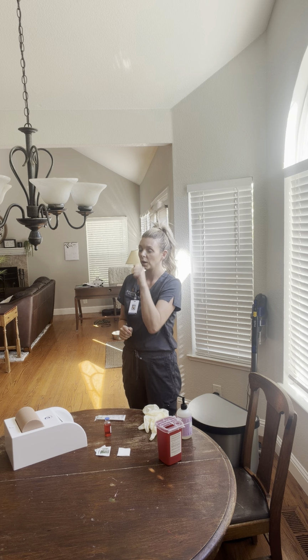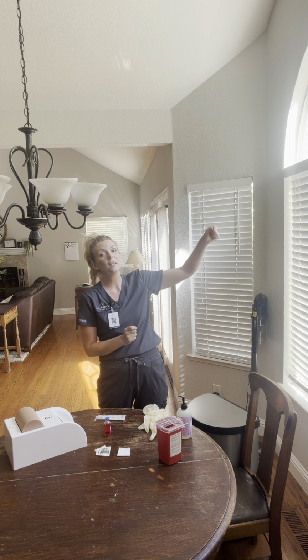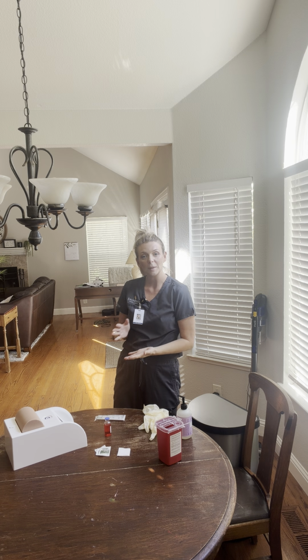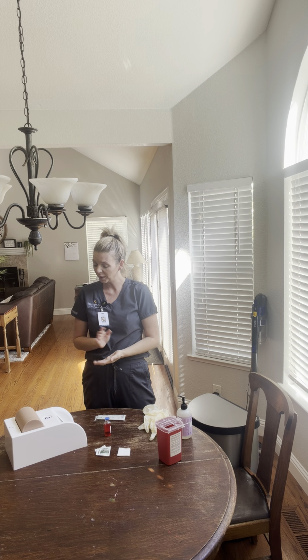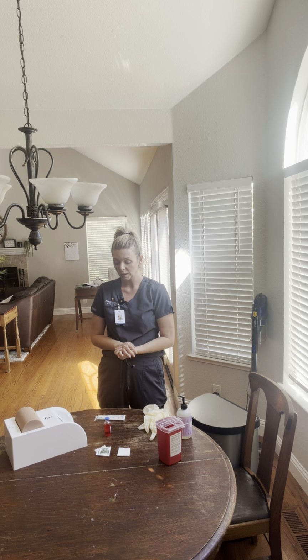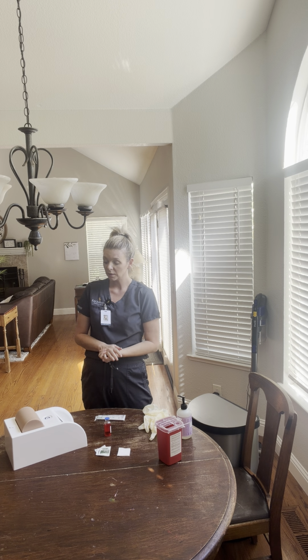So I'm going to knock on the door, and my patient has invited me in. I'm going to provide privacy by closing the door or the curtain for my patient, and I'm going to introduce myself. Hello, my name is Brittany, and I'm going to be your nurse today. How are you? Great, I'm glad to hear that. Well, today I am going to be administering your heparin dose.